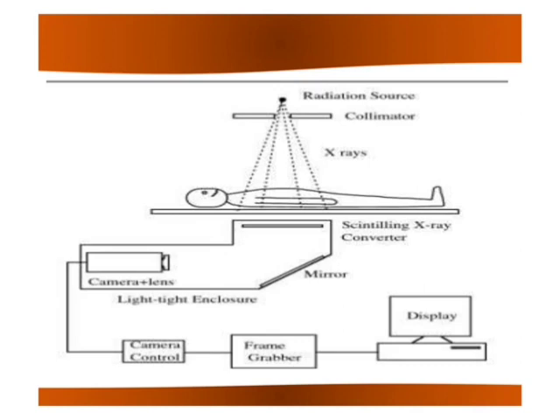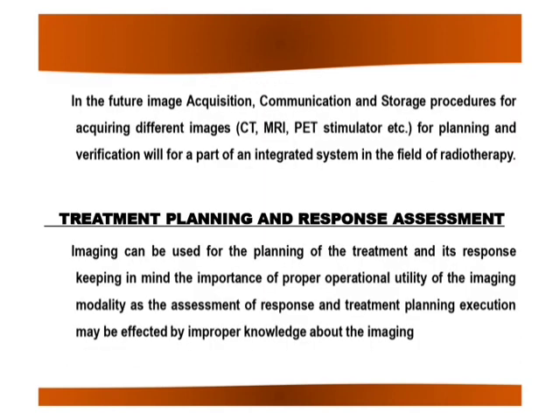So IGRT and tomotherapy are the latest advancement. In the field of radiation oncology, imaging has come of age. Now imaging modalities like CT, 4D CT, and PET CT are integrated with treatment planning and delivery systems, enabling radiation oncologists to plan razor sharp treatment delivery. Especially lung and abdominal cancers benefit from ultra precise respiratory gating and image guided adaptive radiotherapy.